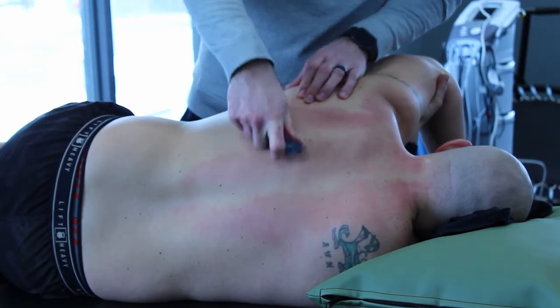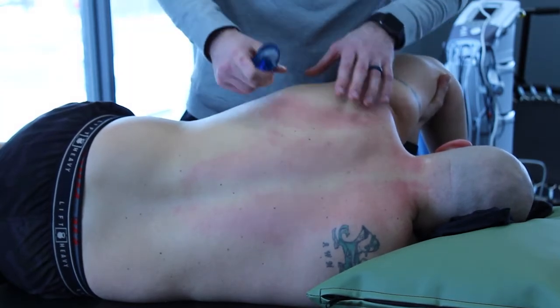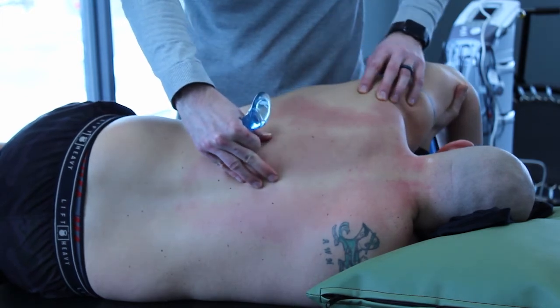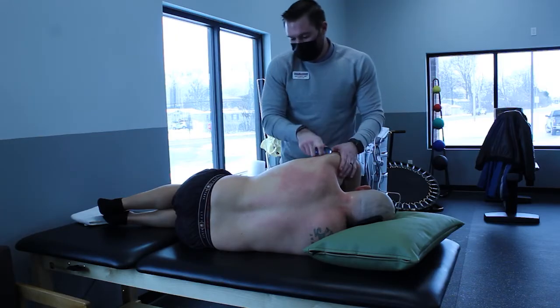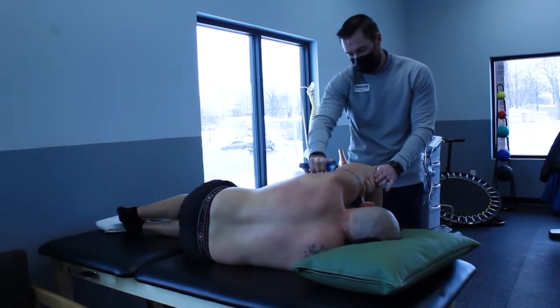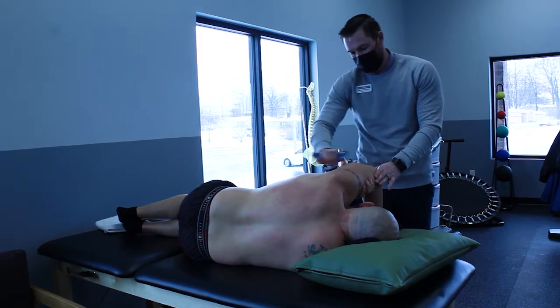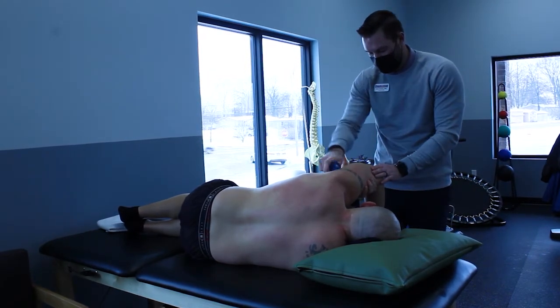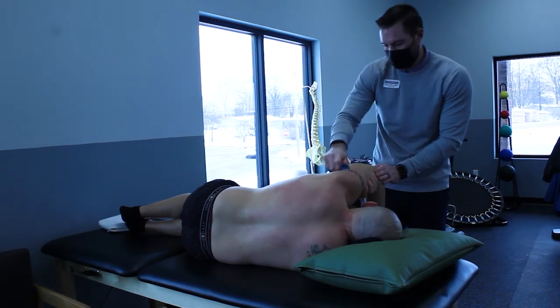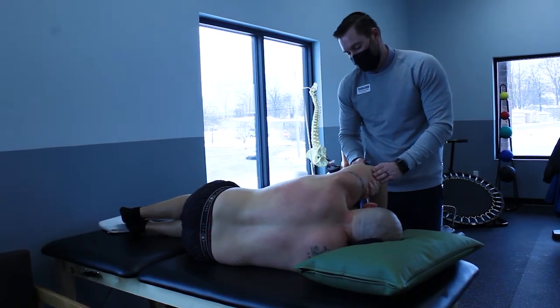Now we're in side lying, working on releasing the tissues that connect to the shoulder blade and attach to the spine. What you don't see is me reapplying a lotion to the skin, so I'm not directly rubbing the tool without a medium between the two of us, so it's a comfortable treatment for the patient. He does have some reddening of the skin, which is normal for the treatment.